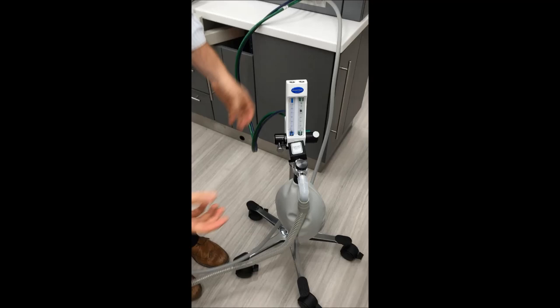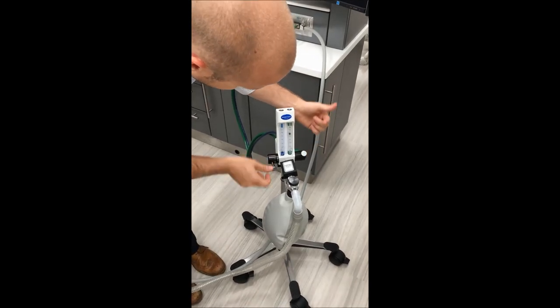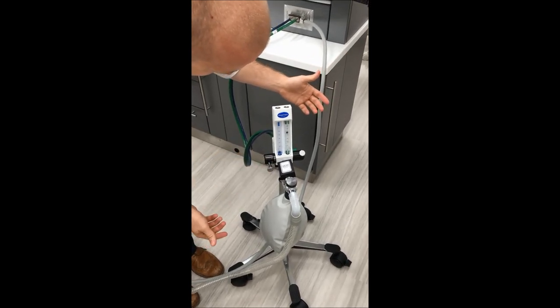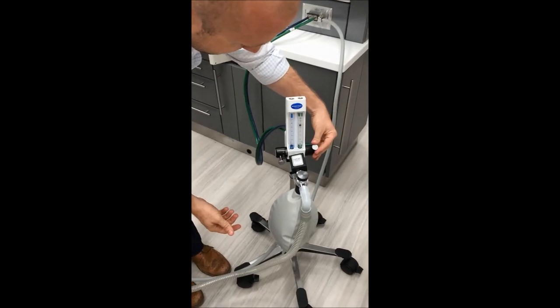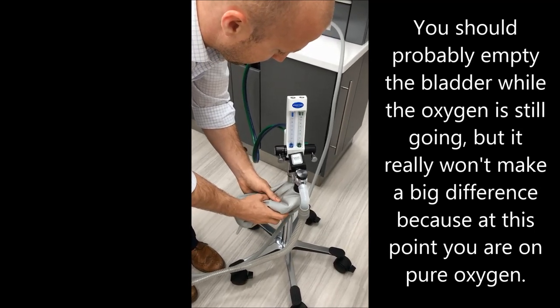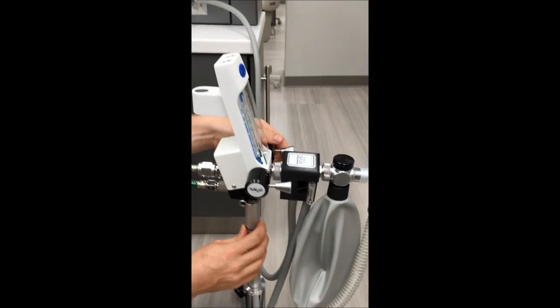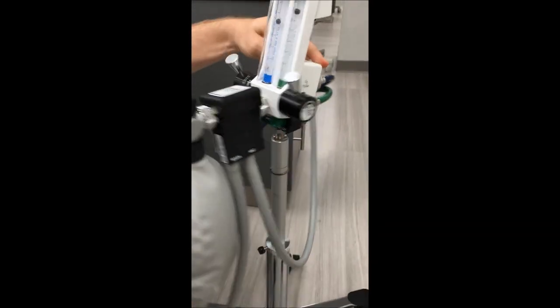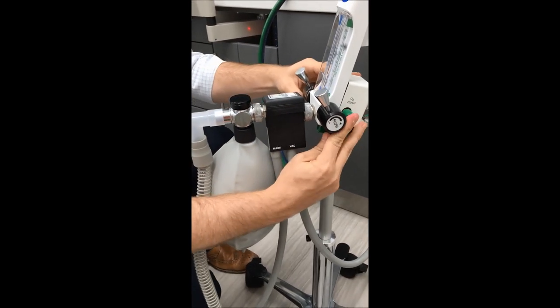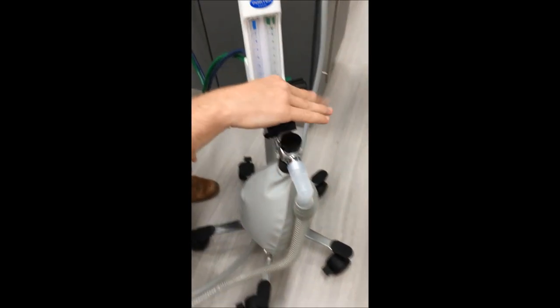When we're all done, there's no reason to purge or do anything other than handling the bladder, because everything is already out of there. When you're done, go back to pure oxygen. We've had nitrous on for however long — now we go to pure oxygen for five minutes. When we're done, shut that down. We still have the scavenger technically going; squeeze out, totally full, and we're good to go. If you have oxygen going on this side of the unit, there's an oxygen flush button — use that if you want to get more in the bag or get more oxygen going.